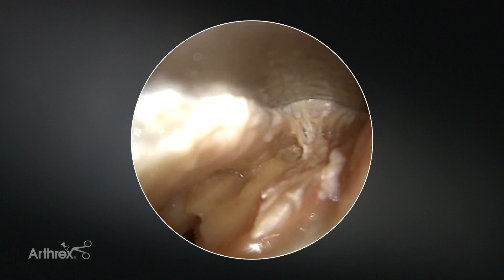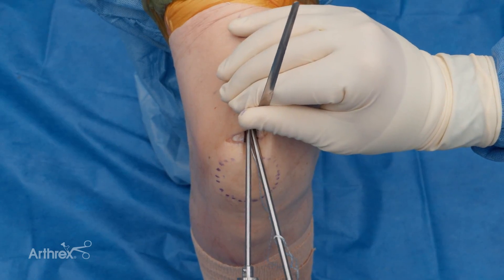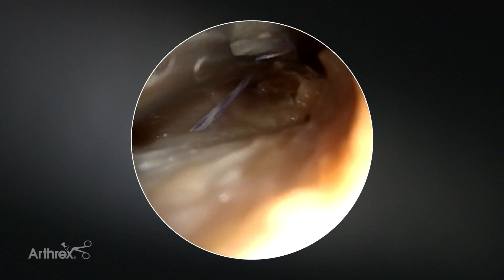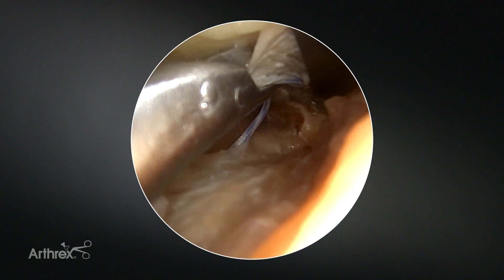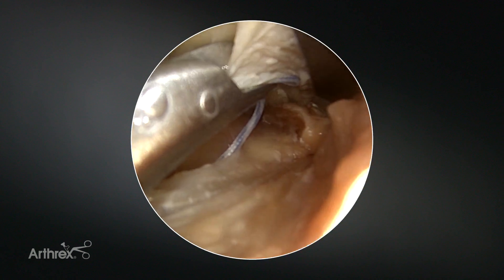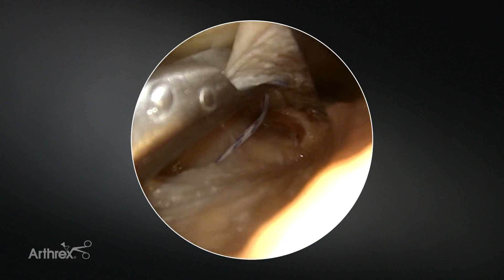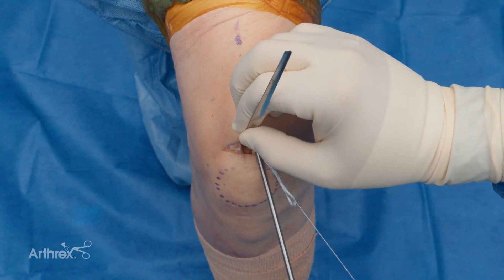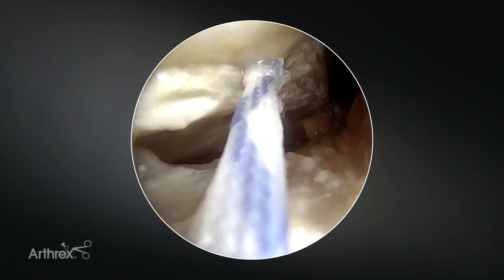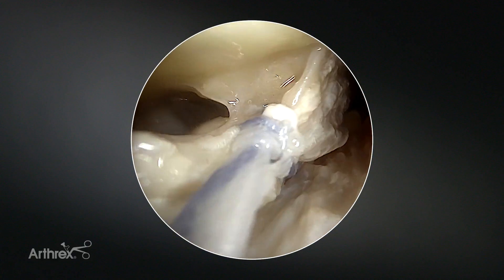You can see where we want to be with our proximal extent of the quadriceps. I'm coming in now with the scorpion device, and I'm going to go ahead and open up the scorpion. You can see I got a really nice big bite with my scorpion, and I'm on the proximal left side of the tendon. I'm just going to go full thickness through and pull out, and as I pull out, I'm going to create a luggage tag. You can see how nice that luggage tag is and the excellent control we have of the tendon.